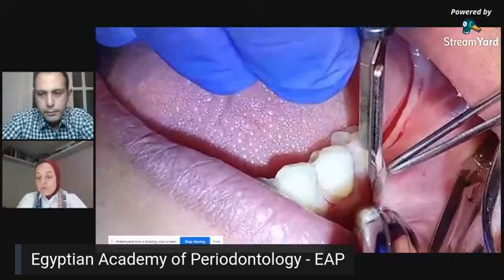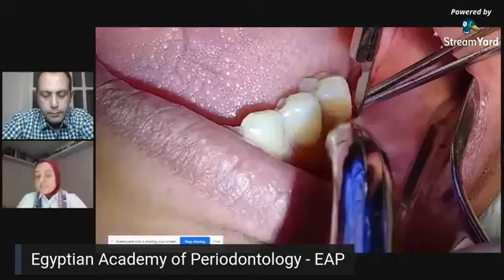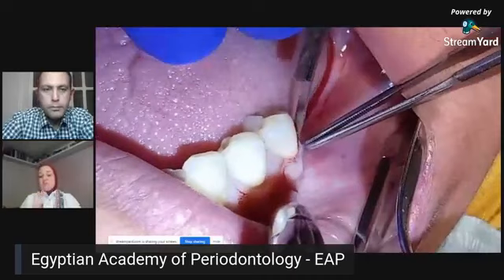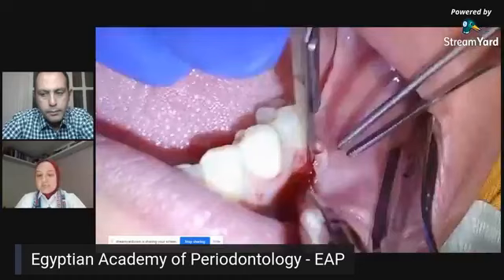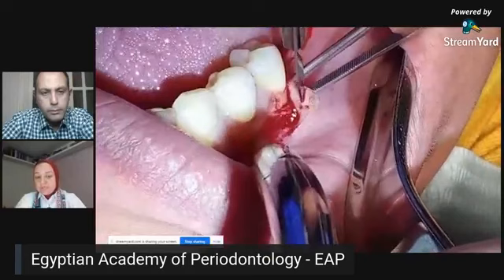As you can see, it's a very tricky and technique sensitive procedure because you have to split the thickness of the soft tissue without any perforations and without any damage of this layer, which is very thin, especially with the bulge of the root of the neighboring tooth. So you go split thickness, much like we do with the recession cases, root coverage cases, or any mucogingival defects or mucogingival problems. Now what we are holding is the outer mucosal layer. We are splitting it.